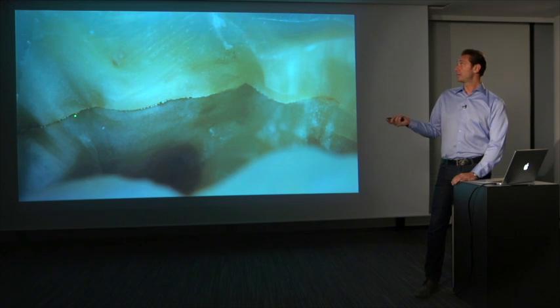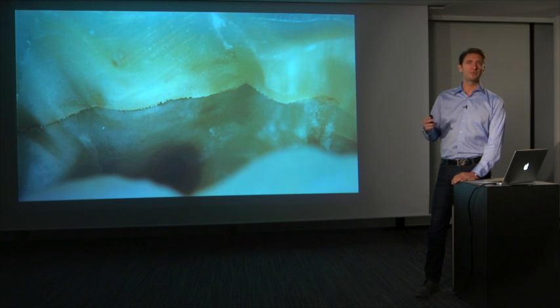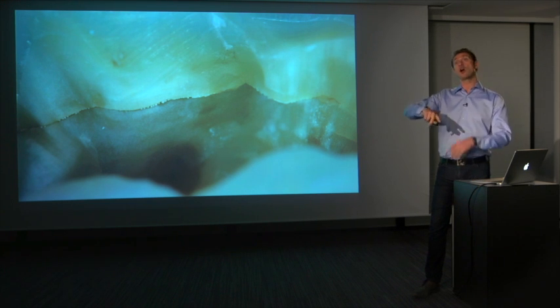This needs cuspal coverage, that's for sure. And this crack also needs to be, I think it should be chased in a way. I think we should remove or clean out the crack, remove the cusp, and at the same time follow the crack line to the outer contour of the cavity, because if we don't do that, and we want to keep the tooth vital, of course, there will be some issues.